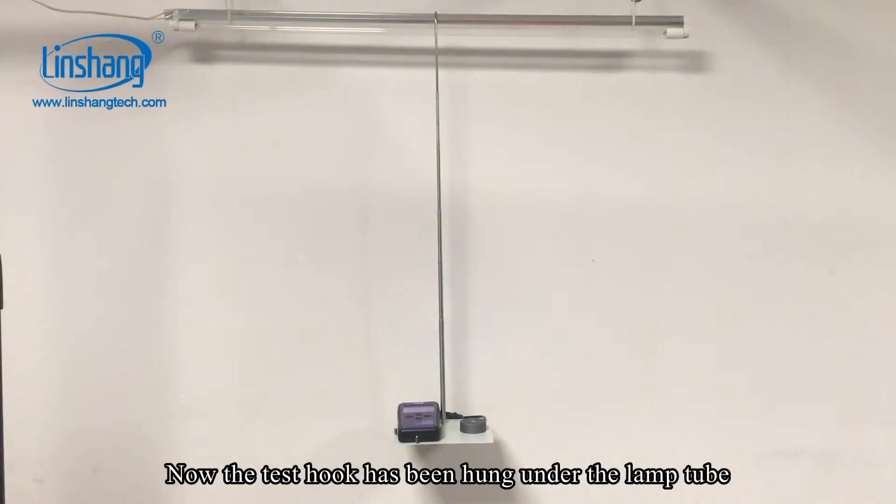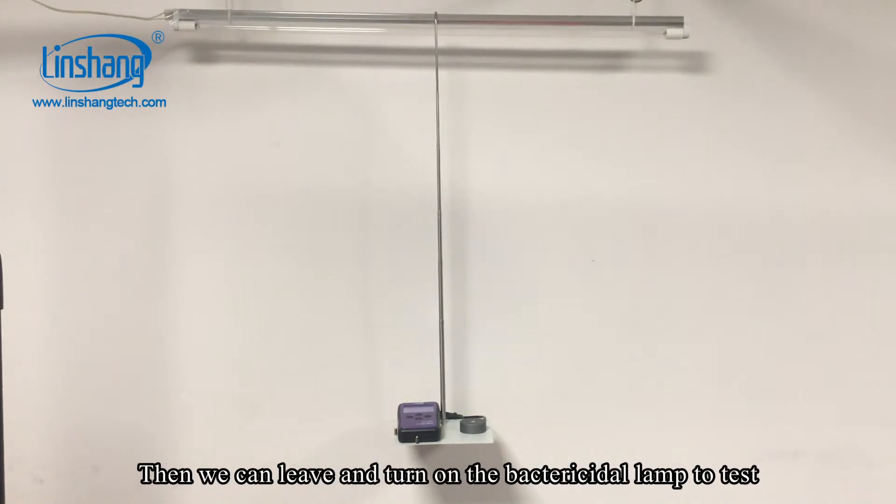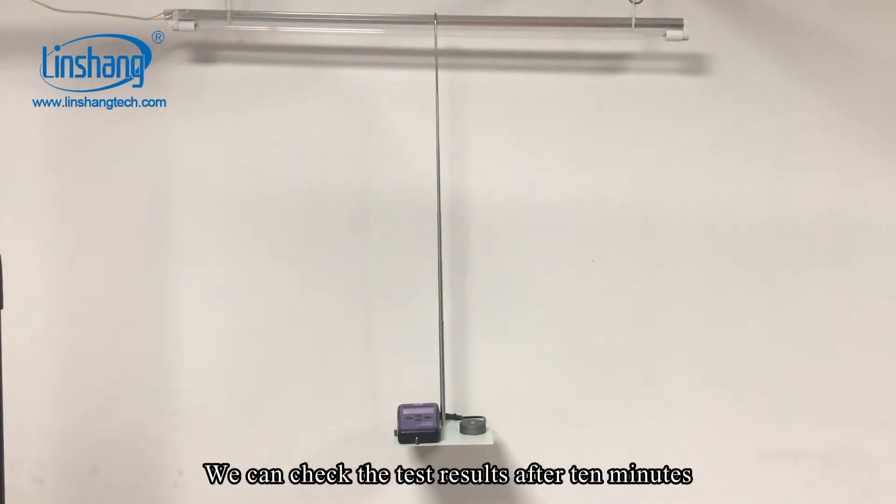Now the test hook has been hung under the lamp tube. Then we can leave and turn on the bactericidal lamp to test. We can check the test results after 10 minutes.